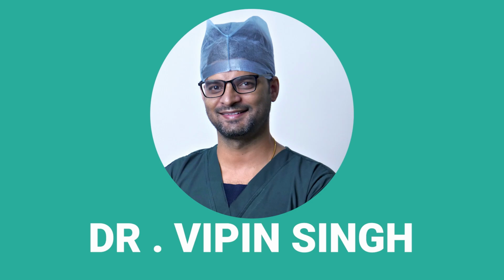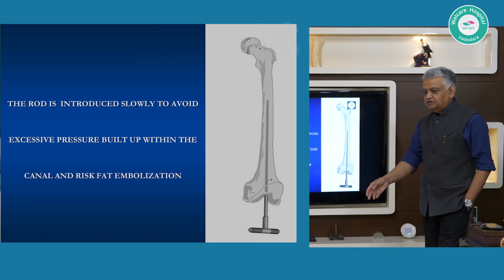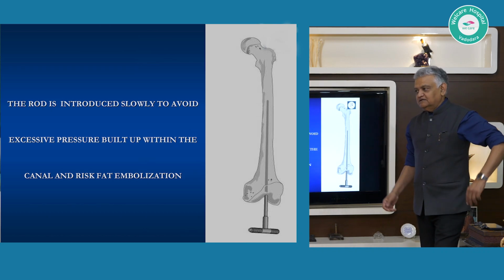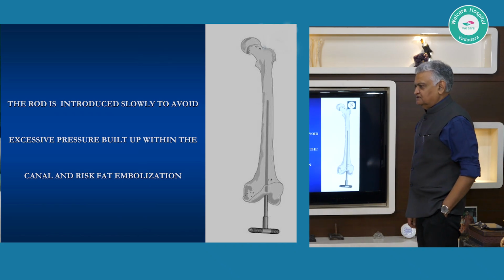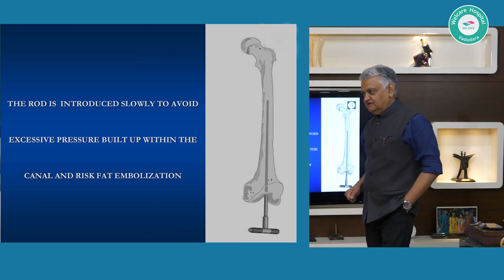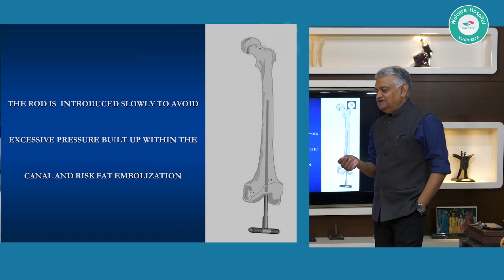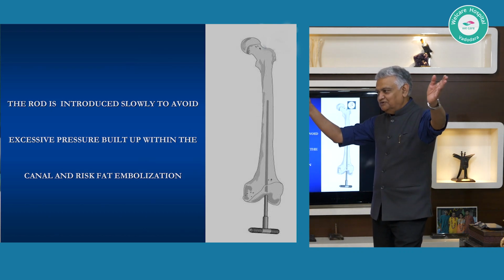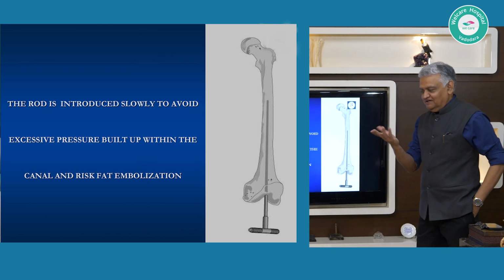What's your opinion, sir? They say good luck to them, but I think rather than diluting, evacuating it is far more common sense. There is dirt here, I can put water in it and allow it to flow around, or I can just vacuum it out. So I prefer to vacuum it out. In fact, if you trigger my debating instinct, I will say that diluting it means you are reducing the viscosity, so now if you pressurize it, it is easier for it to migrate into any small openings. So in my opinion, vacuuming it out is much better.